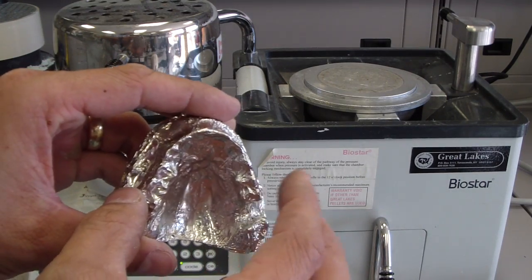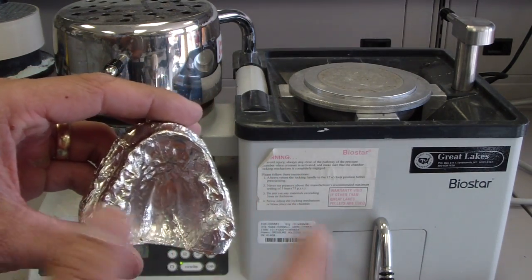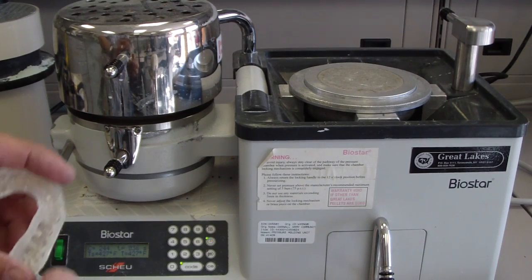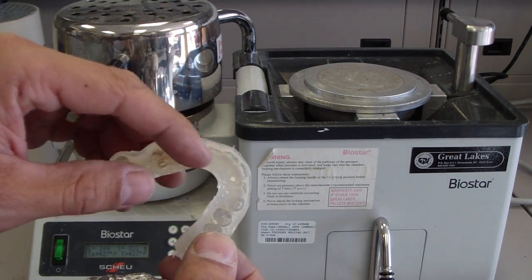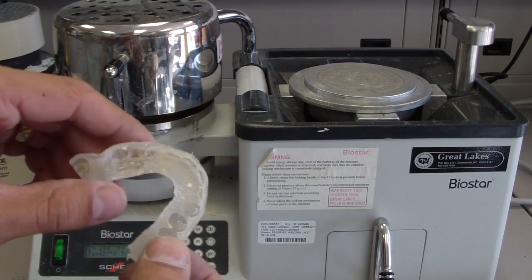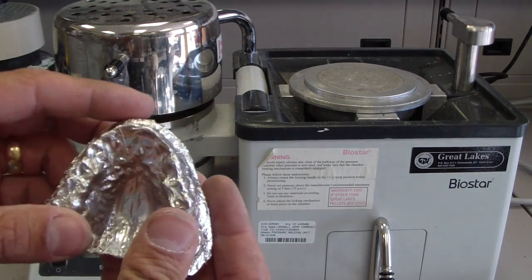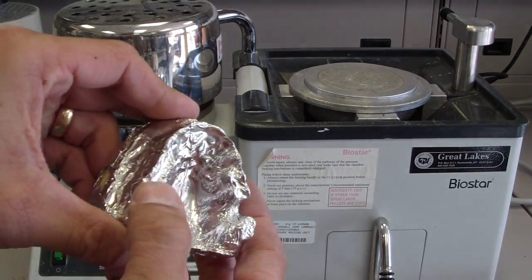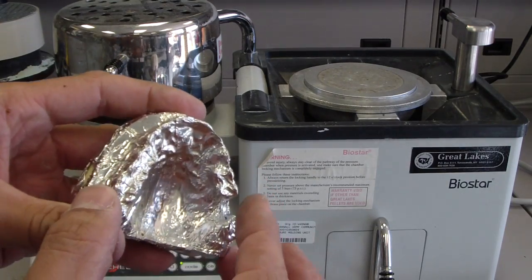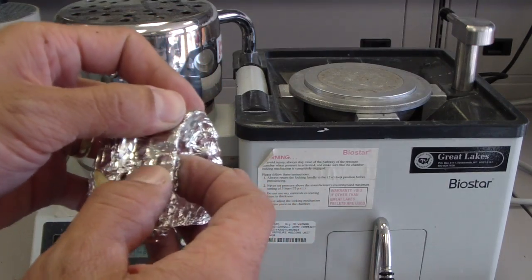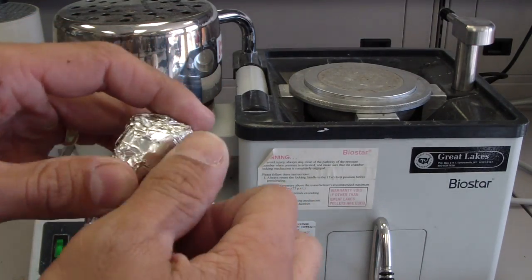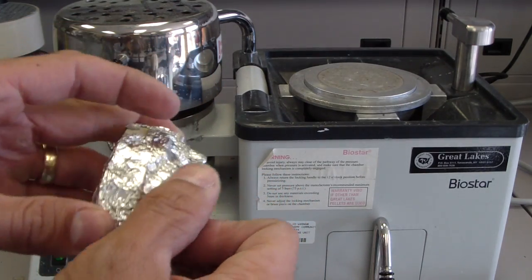The company suggests wrapping the cast in tin foil like a baked potato to ensure a nice clear bruxism splint. In comparison to this one where I didn't use tin foil during vacuum forming, although the foil is difficult to remove after forming, it makes a huge difference in the clarity of the prosthesis.